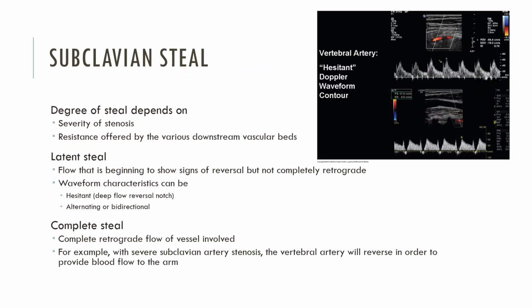I briefly want to talk about a subclavian steal. I mentioned just a little bit how when we're assessing the vertebral artery, we really want to make sure that the blood through that vertebral artery is going towards the brain. There's something called a subclavian steal, where if my patient's aortic arch looks something like this, and the brachiocephalic comes off the right, it splits into the subclavian and the carotid.